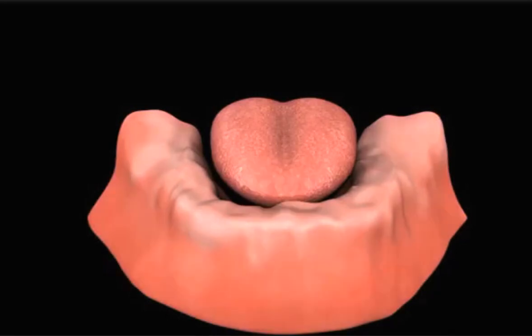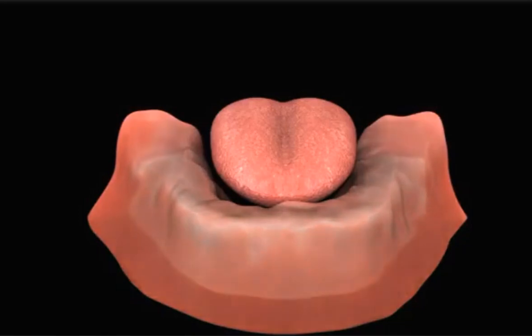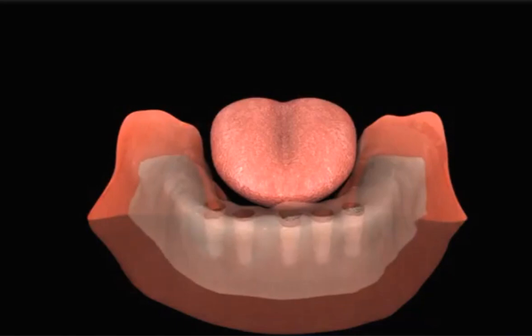When you lose all your lower teeth, you also lose bone and tissue in the lower jaw. One option to replace your missing teeth is with an implant-supported fixed denture.